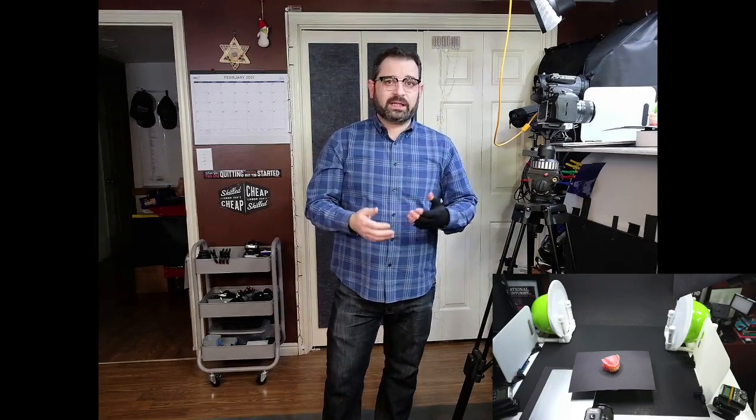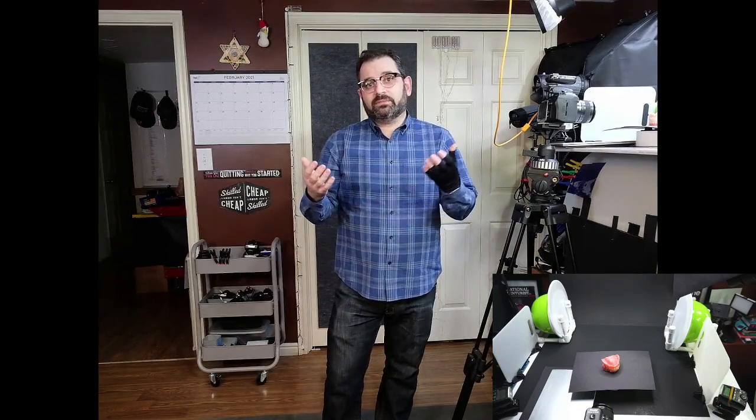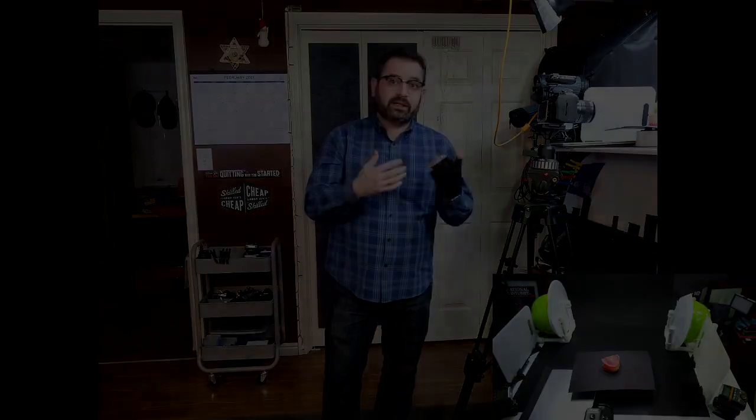I'm going to show you a couple of different reflectors and a couple of different diffusers that I personally utilize with my tabletop photography. And maybe from what you guys see, you can find something that can help you guys out as well. So let's go ahead and take a look.